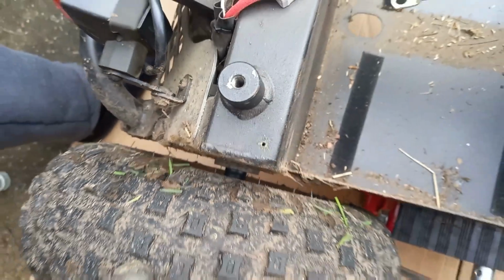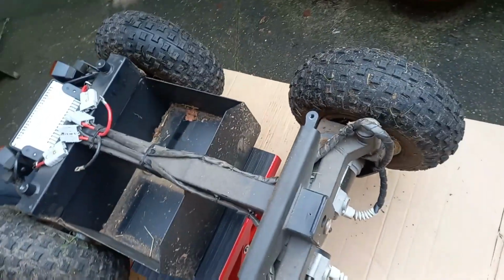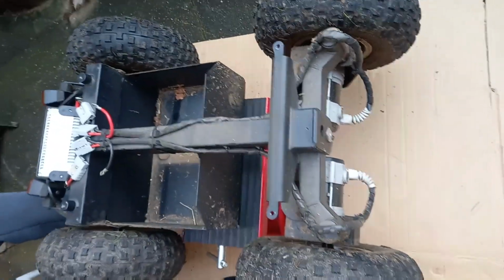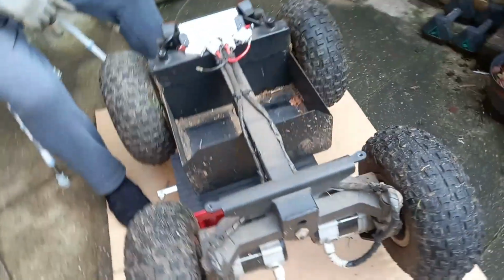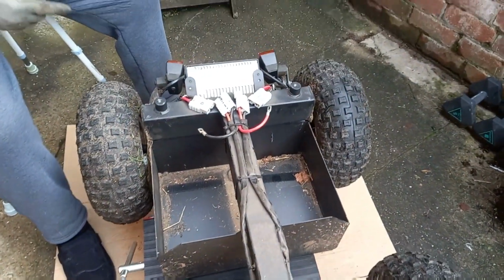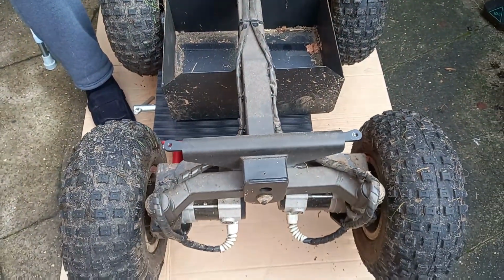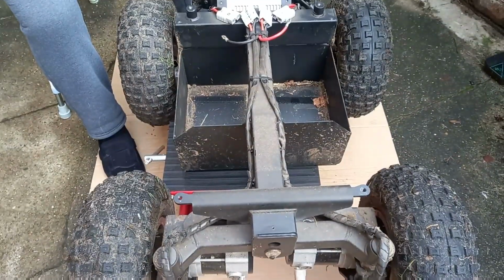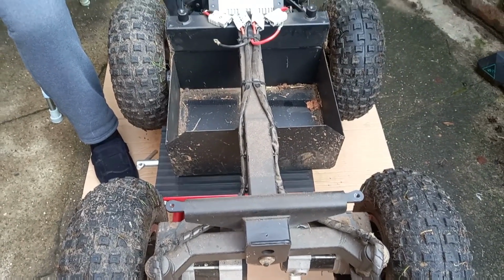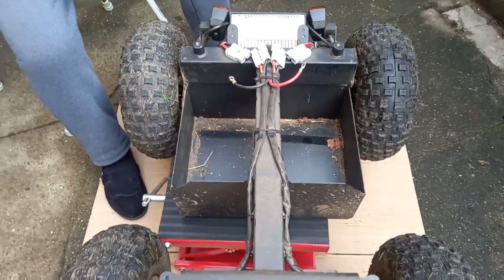Which means that eventually that'll strip the splines off the motor shaft and the hub as well, or one or the other. And you lose your drive altogether. So that's another job we've got to do. We've got to tighten those up and put some copper grease or something on the splines to stop any fretting between them, and then that'll be as good as new. But it's a good job we noticed and did the batteries, otherwise we wouldn't have noticed that, you see. I'd have just carried on using it.